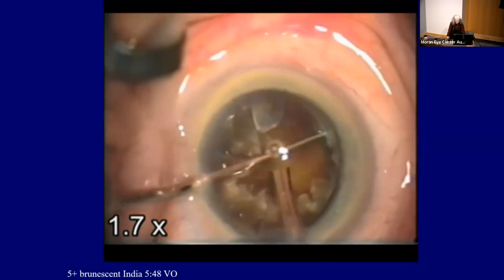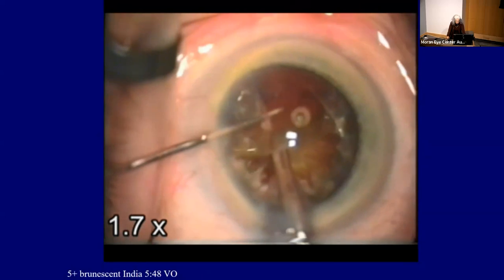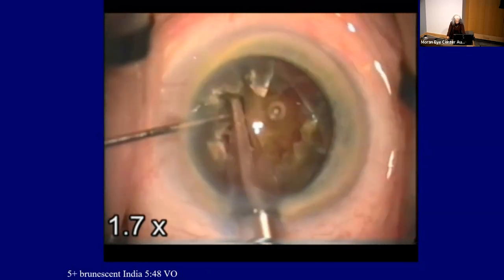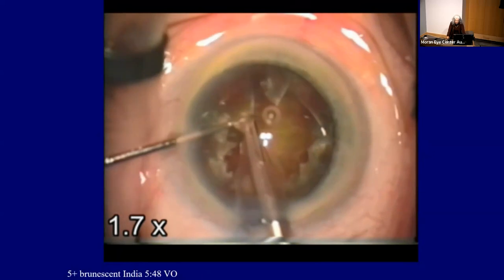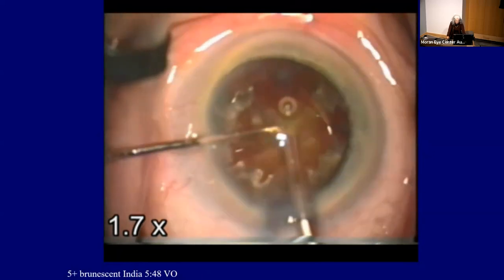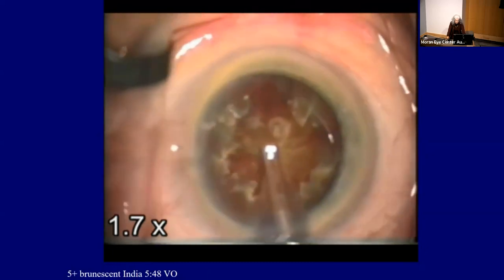And then once that happens, and you'll see some more sped up things and how reproducible this is, you're just barely sort of seeing red reflex at this point. And see, I'm not letting the whole thing come because I don't want to leave some really dense areas that may need to be removed in the anterior chamber, because keep in mind, all of my ultrasound is happening at the iris plane or below at this point.